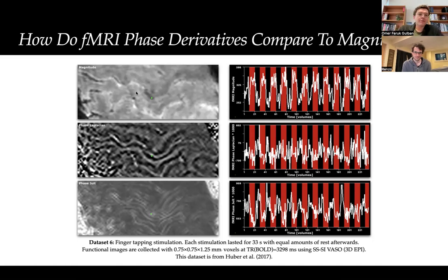When I compute the phase Laplacian, I don't have the phase results here, by the way, because I didn't have time to process the phase data by itself, so I just skipped it for now in the context of this ISMRM abstract. In the phase Laplacian data, again, the same voxel, maybe it is not so clear, but you can still see this up-down movement in the response curves. This is a single voxel, by the way. I am taking a single voxel and looking at the time series.